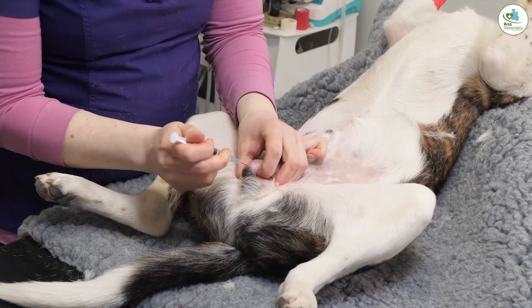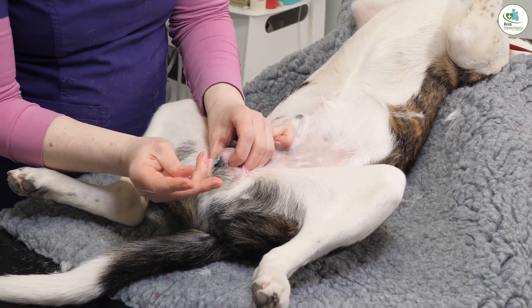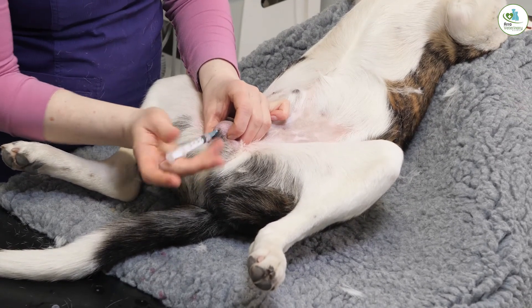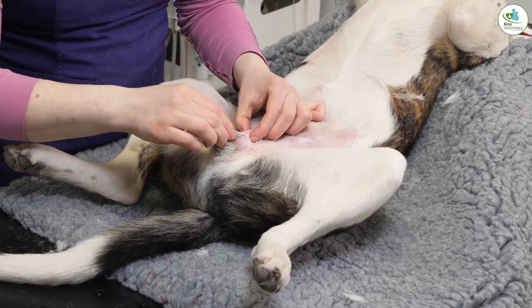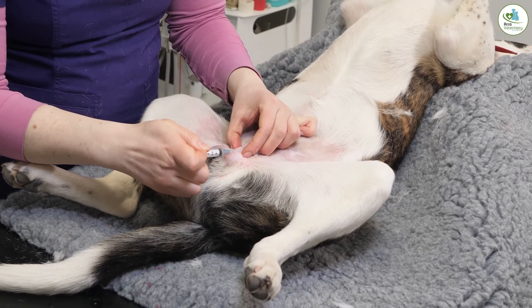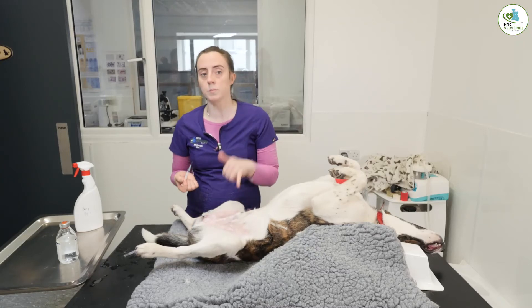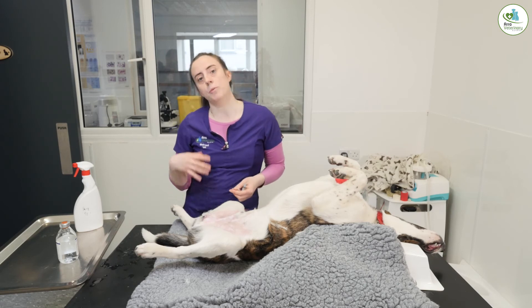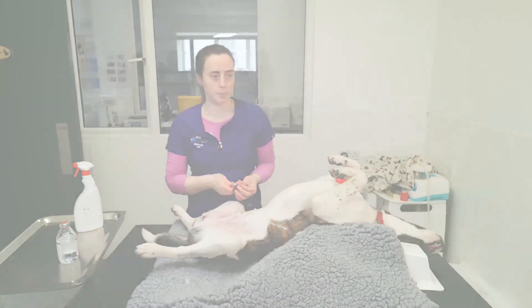This is numbing the area so he won't feel the neutering as much, and it'll also provide pain relief after the surgery. That's another site done, and now our incision site as well. I like to put some into the skin so he won't feel the incision either. That needs about five to ten minutes to work. We just need to do a small scrub again because I've touched the area, and then I'm going to get prepared to induce him and get myself prepared for surgery too.